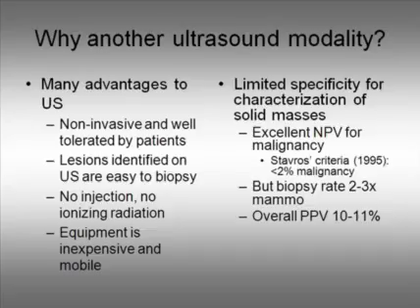Now, why do we want another ultrasound modality? We know that ultrasound is an excellent modality for evaluating the breast. It's non-invasive. There's no ionizing radiation. There's no intravenous injection. It's very well tolerated by patients. The equipment is relatively inexpensive and widely available. And when we see something on ultrasound, it's generally extremely easy to biopsy.